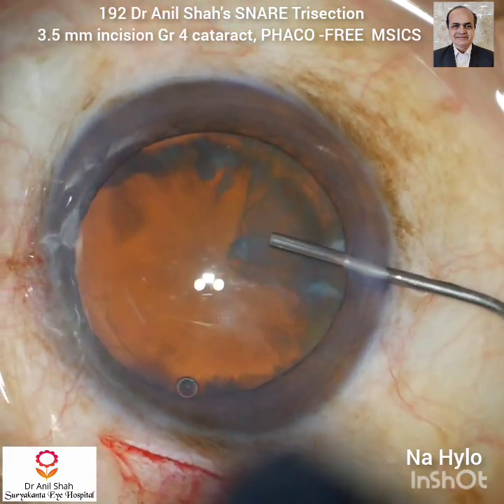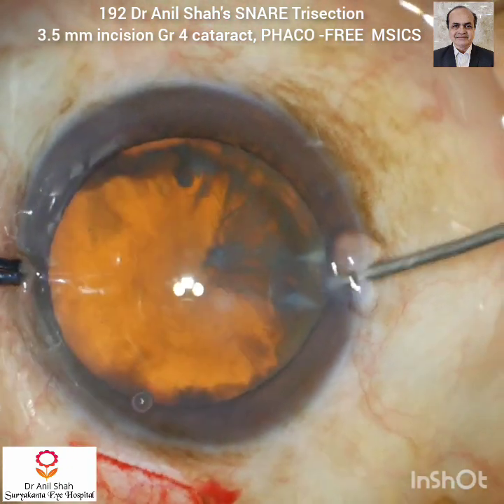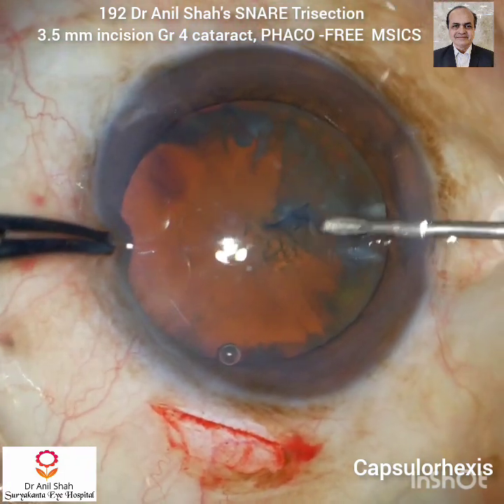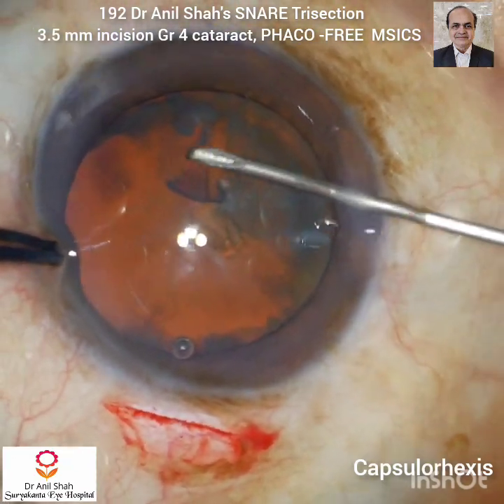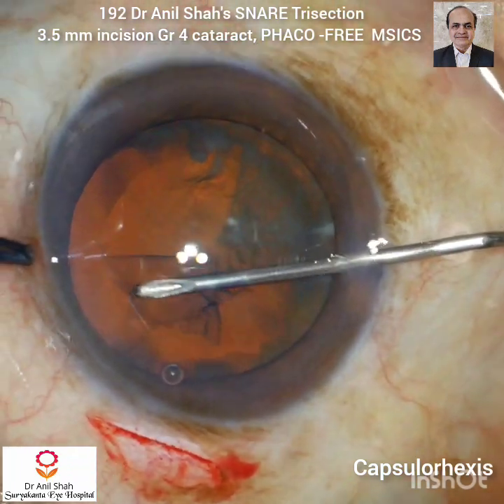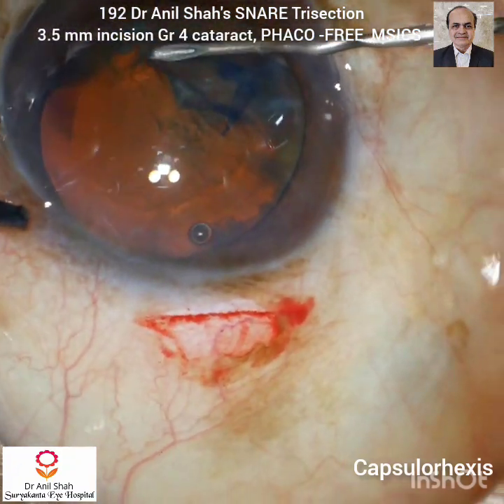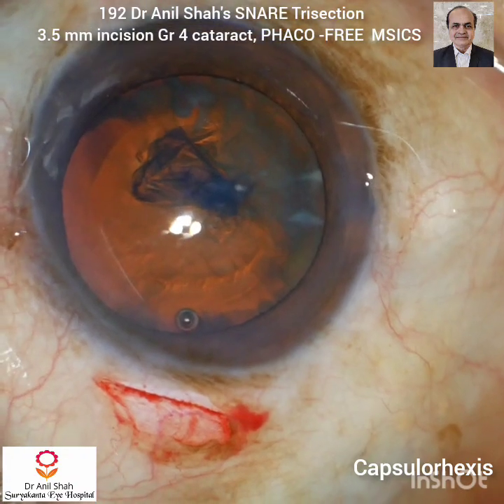I preferably use sodium hyaluronate in all the cases and it has many advantages. Now with a 26 gauge cystotome I am doing a capsulorrhexis. I usually do capsulorrhexis with the cystotome and sodium hyaluronate makes the chamber stable, so the rhexis is also performed very easily.